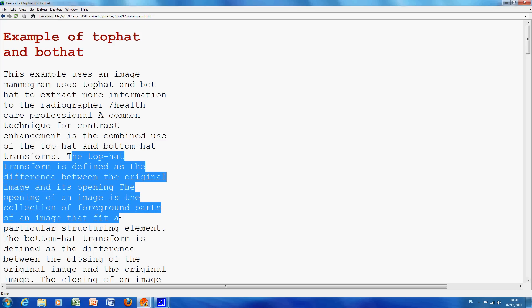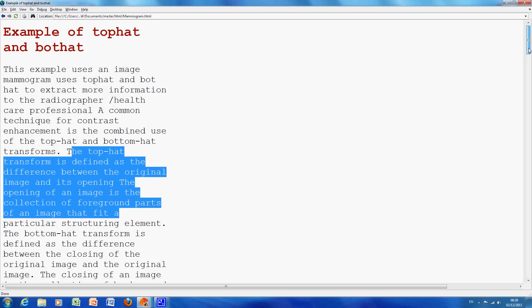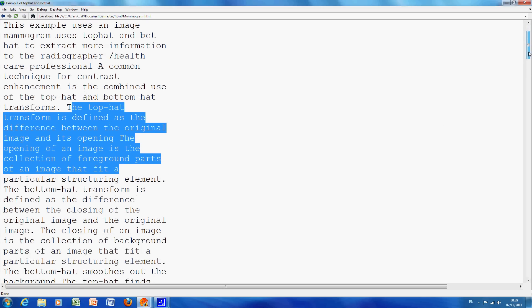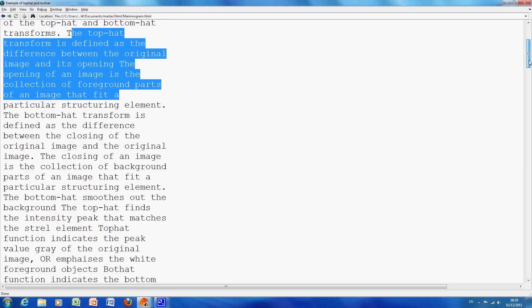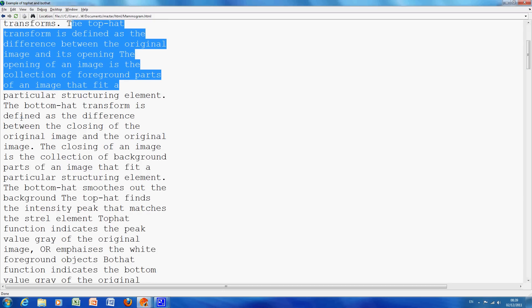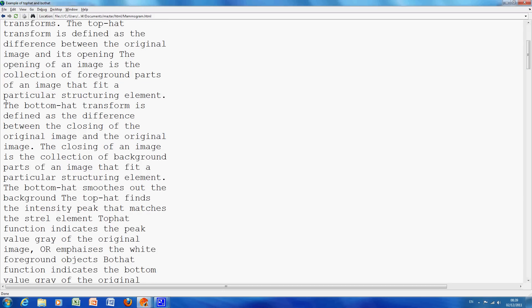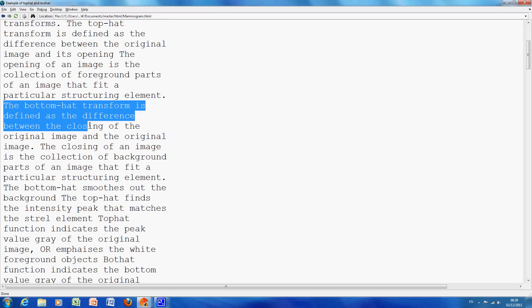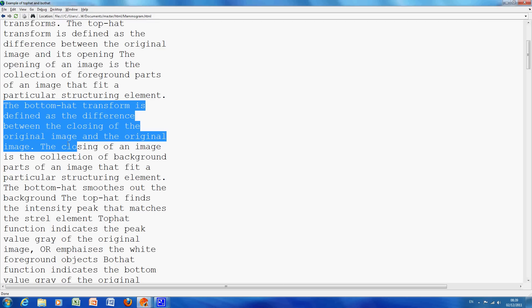So, there's my TopHat definition. The difference between the original and the opening, and if you remember, the opening is an erosion followed by a dilation. The BotHat is to find the difference between the closing of the original and the original image itself. So you take the original image, you close it, you get that result and you take away the original image. And what will that give you, it'll give you, as we'll see, the intensity troughs.